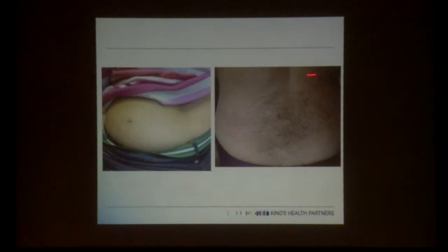So I usually show this diagram. This is a patient, that's his midline, and he had a surgery. When I did his surgery, now it was 15 years ago, an orthopedic surgeon did this curvilinear incision and removed the L3-4 disc. He came with a recurrence, and I went through the endoscope, and that's the incision now. This is another patient, that's the midline, and that's the incision. So it's cosmetically very, very acceptable.